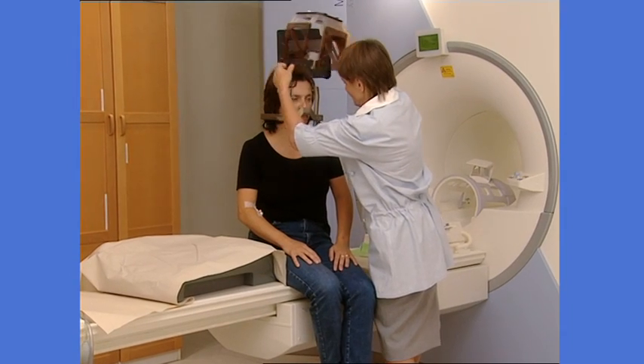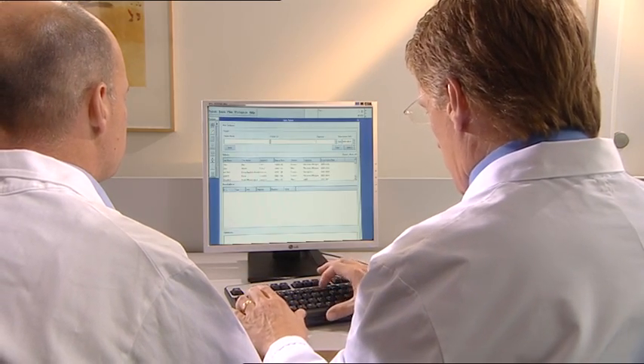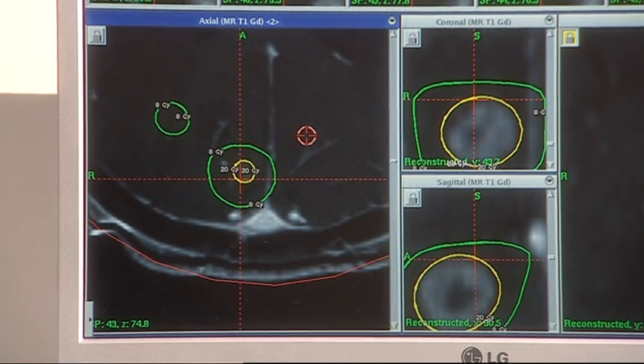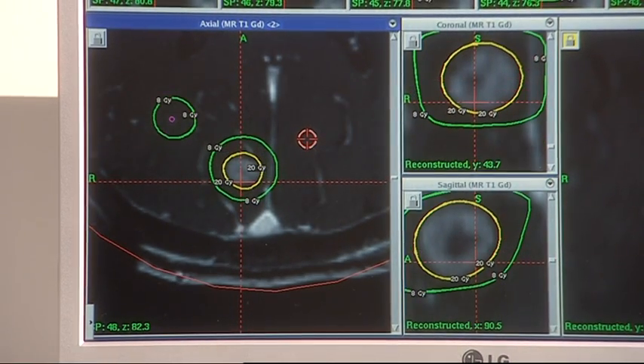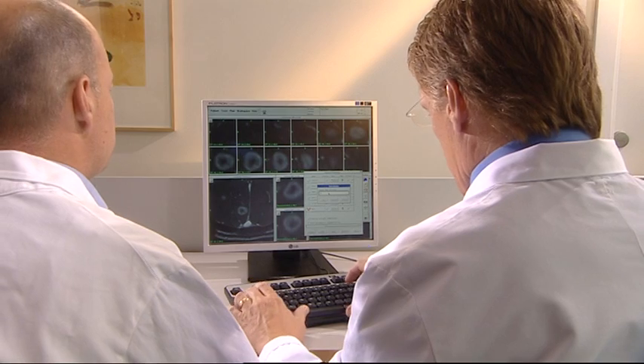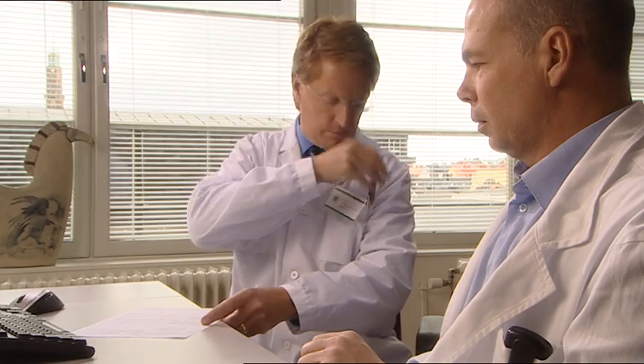The images are now transferred to the sophisticated treatment planning computer. Once the images have been taken, you can rest while the doctor, often together with another specialist, develops your treatment plan. Each treatment plan is unique and individually designed to address the particular patient's medical condition. The specially designed treatment planning software assists the doctor in preparing the treatment. For added security, the final plan is rechecked and approved.